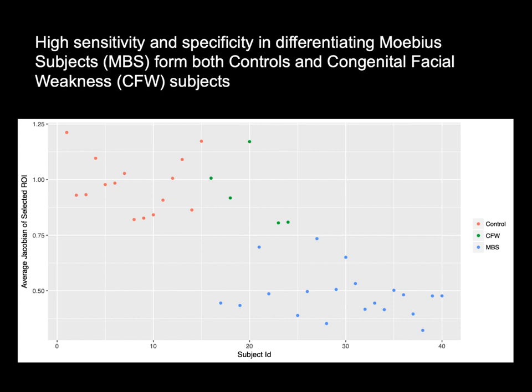So there are complicated Möbius and there are pure Möbius. So we had the controls group and then a subgroup of Möbius. That voxel-wise analysis identified, in essentially the effect size map, that region as particularly relevant.